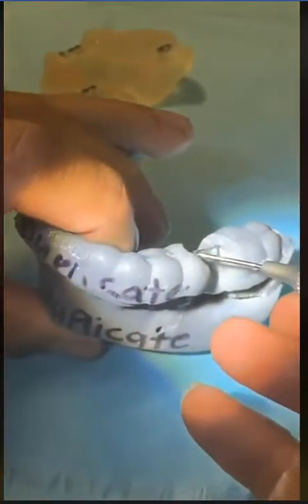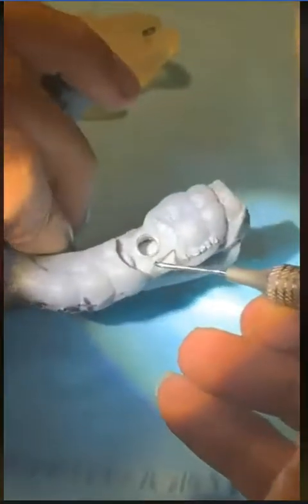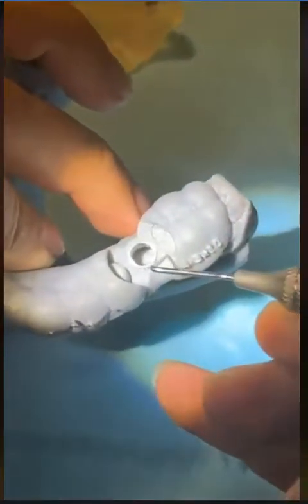Another thing I want to tell you about the guide is this. Take a look at these spaces. These are generated through the computer. We have a tooth in this area, we have a tooth in this area, and when you generate that, these spaces are left. So we can seat the guide. And one of the things that you need to check on your patient is to make sure there is no space between the tooth and your guide. You see this space? There is no space here.